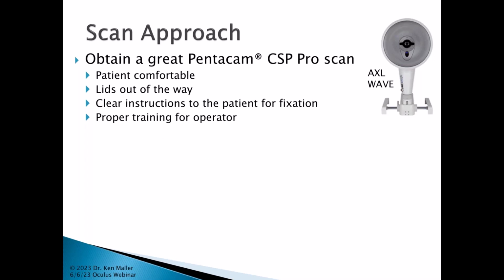I know the majority of practitioners delegate out the scans to their techs. I personally take my own scans and have a tech assist me when I'm doing that, which does have a couple of advantages and something you may want to consider. I do know it's sometimes difficult to work that in with patient flow, but one of the things that I have an advantage of by taking my own scans is I know exactly at the time of the scan if I have data that's captured that's appropriate for designing, or if I need to repeat the scan.